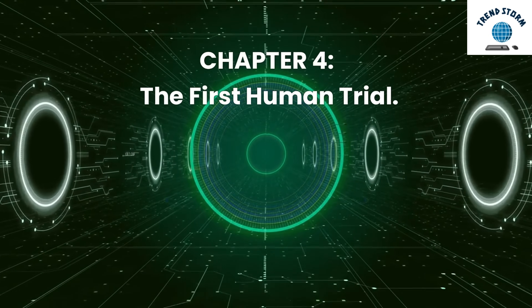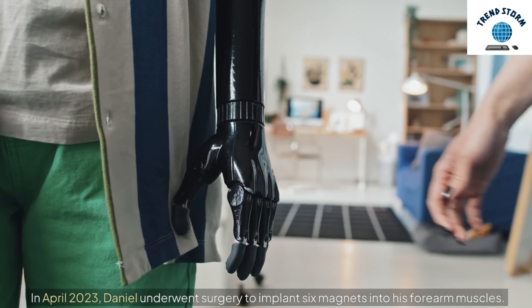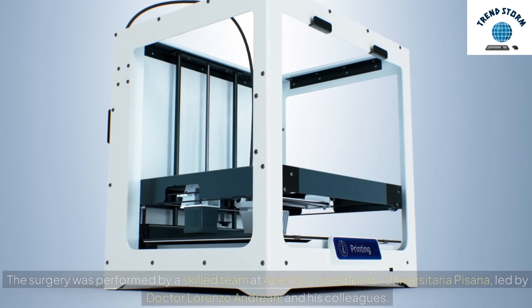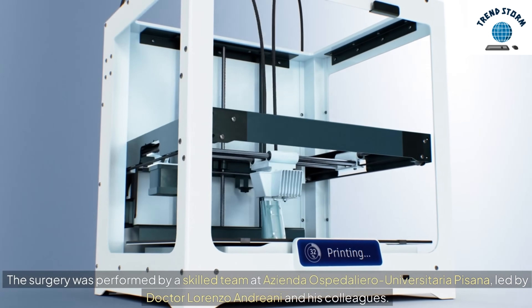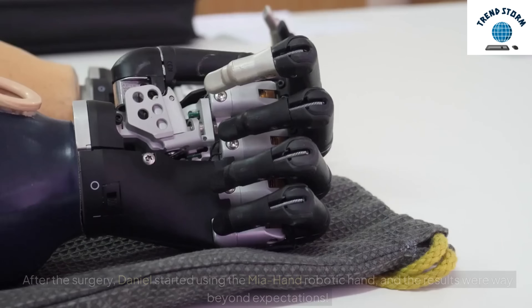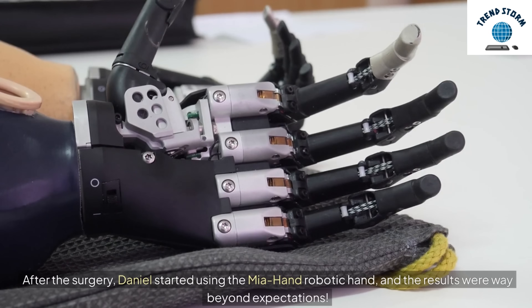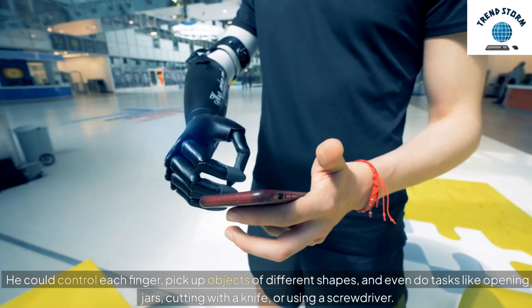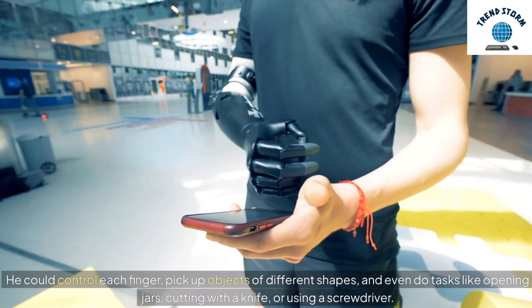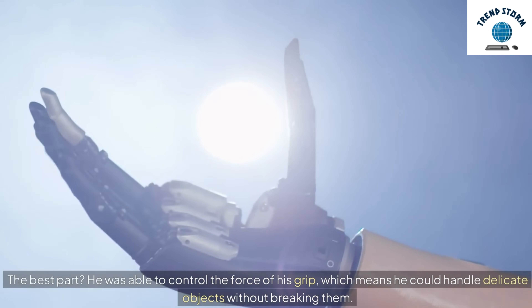Now let's meet Daniel, the first person to try this amazing technology. In April 2023, Daniel underwent surgery to implant six magnets into his forearm muscles. The surgery was performed by a skilled team at Azienda Ospedaliero Universitaria Pisana, led by Dr. Lorenzo Andreani and his colleagues. After the surgery, Daniel started using the Mia Hand robotic hand, and the results were way beyond expectations. He could control each finger, pick up objects of different shapes, and even do tasks like opening jars, cutting with a knife, or using a screwdriver. The best part? He was able to control the force of his grip, which means he could handle delicate objects without breaking them.